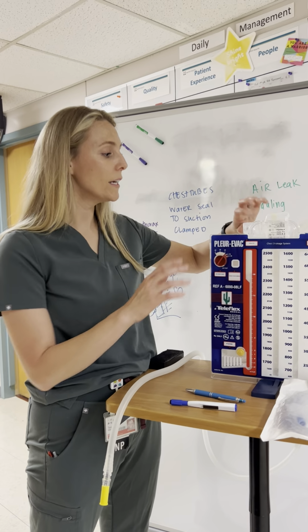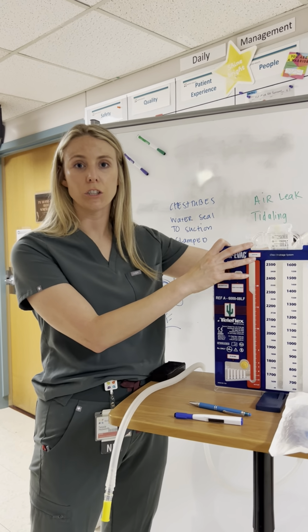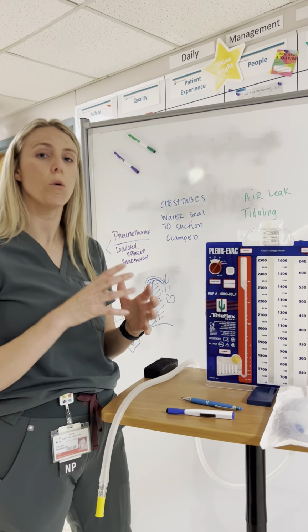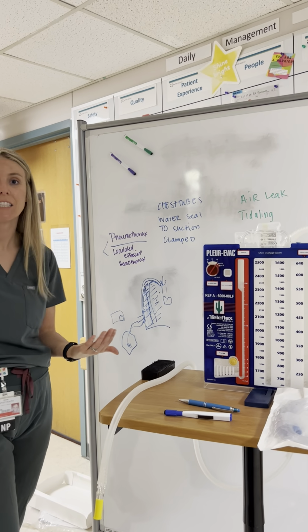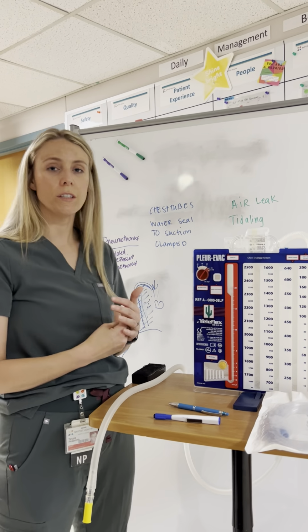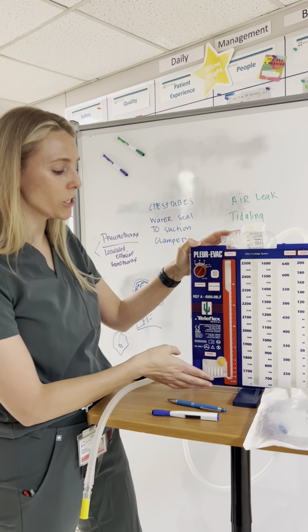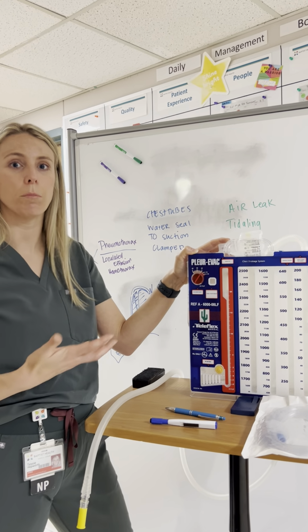So basically, if the doctor tells you to place the chest tube to water seal, you just take the suction off, okay? It's important that you're assessing your patient once you've made this change, because you no longer have a negative pressure. They could have an increased risk of developing tension. So water seal, and then continuously reassessing your patient. Most of the time, providers do not water seal a chest tube if they still have a consistent air leak, because you need that negative pressure or the negative suction to keep the lung up.